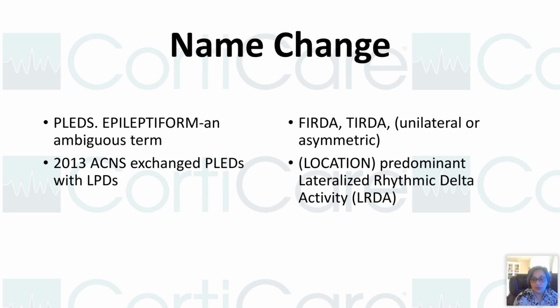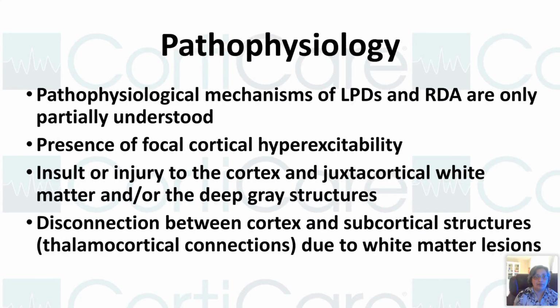So over the course of this presentation, I would still bring the term PLEDs because that's how the terms were initiated and how we were explaining earlier. What's the pathophysiology of these patterns? It is not fully understood. Whatever understanding we have tells us that there is hyperexcitability of one particular area of the cortex, so basically focal cortical hyperexcitability.